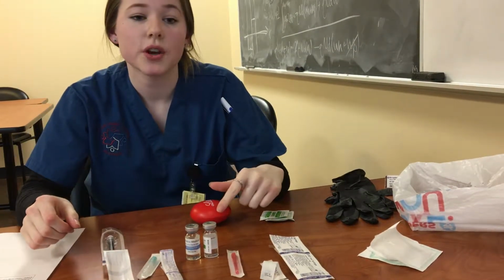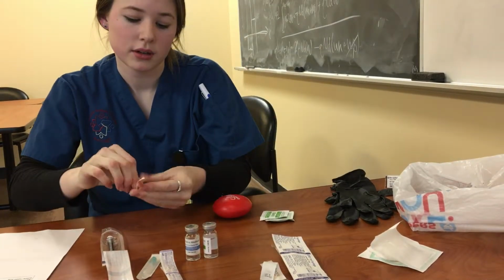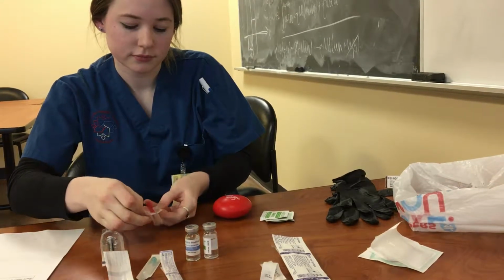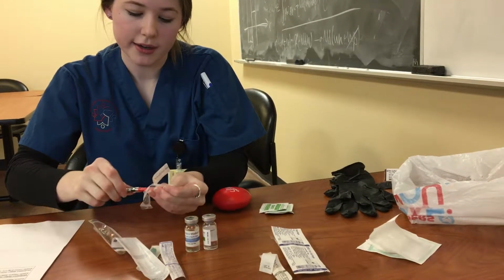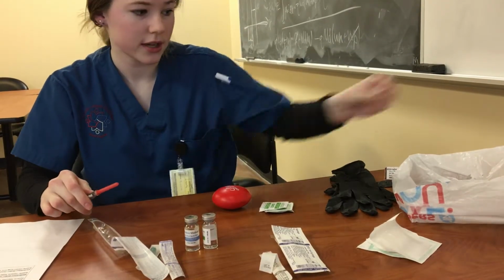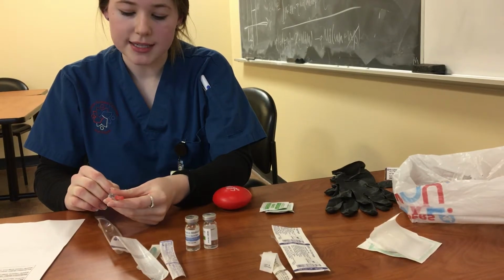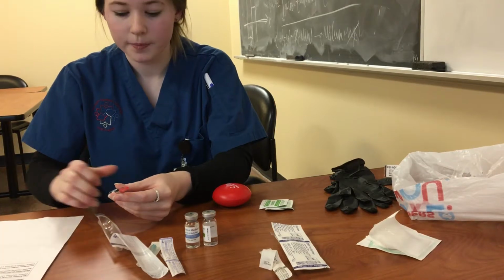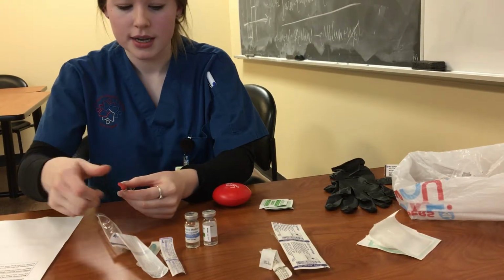And because we are withdrawing from a vial, I need to attach a blunt needle. So I'm just going to luer lock that in. Perfect. I can discard that in my garbage. And I'm going to be aspirating the amount of air of the medication I would be injecting, which is 1 ml. So I'm going to pull back on the syringe to 1 milliliter and take off the cap.